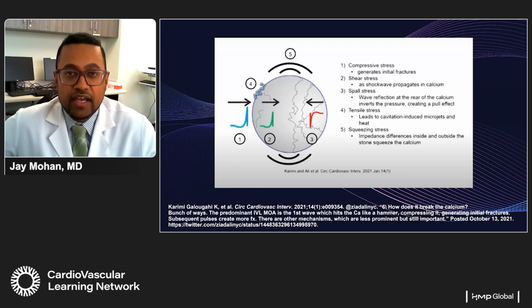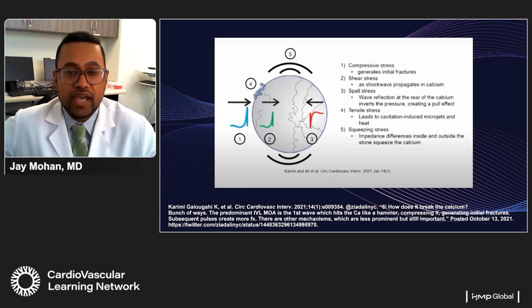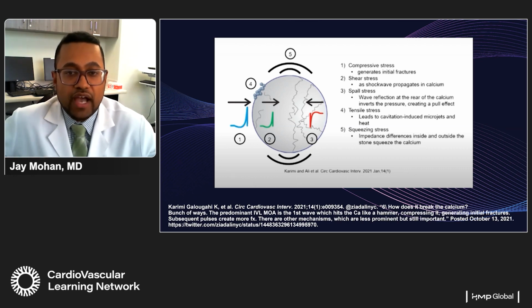Ziad Ali has really been a pioneer in this space, and with his work he has shown the multiple mechanisms of action of how to treat calcium. The unique thing about shockwave lithotripsy is that not only does it fracture calcium, it does it in multiple different ways. When you generate that acoustic energy, you cause a compressive state on that calcium, basically squeezing the calcium, and it generates those initial fractures.